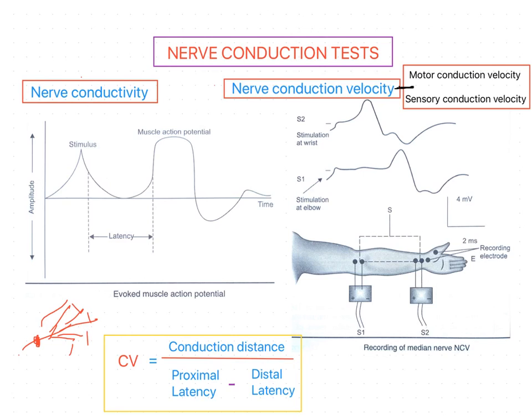With lesions in which degeneration does not occur, it may be possible to determine the level at which the impulses are blocked by testing at different points on the nerve trunk. Stimulation below the site of the lesion should elicit a response, but not stimulation above it.